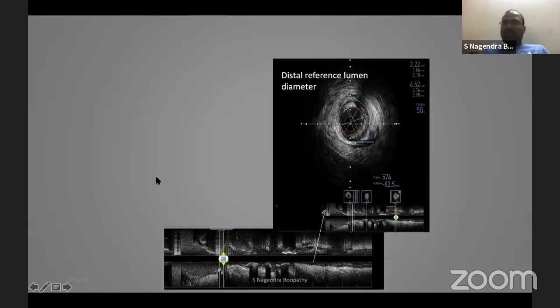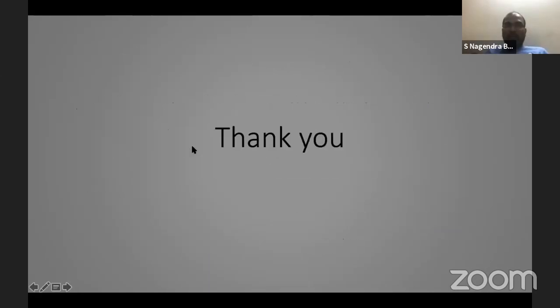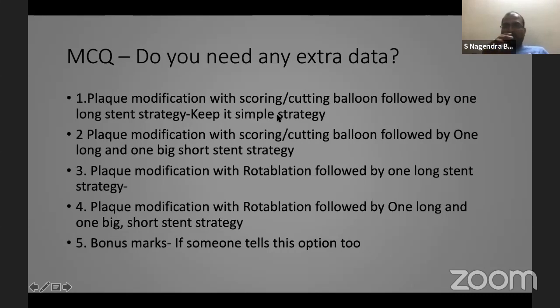This patient is doing well even now on ticagrelor 60 milligram, I mean twice a day, along with aspirin 81 milligram. This patient has been readmitted. We did a check angio after almost 15 months. All her stents are patent. I hope you learned from this particular case.